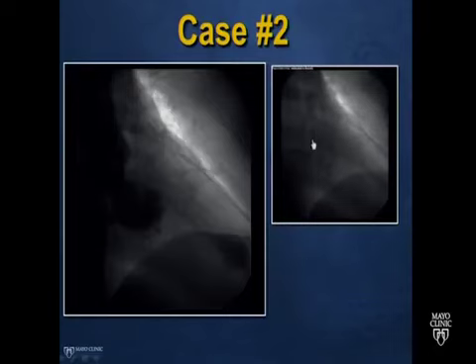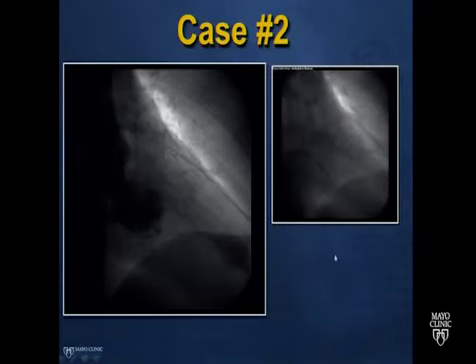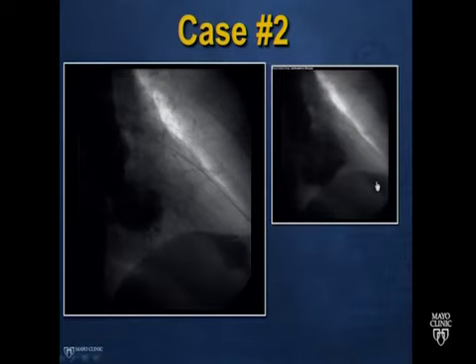Here's another case that you might see. This is apical hypertrophic cardiomyopathy with an apical aneurysm. So again, in diastole, that dye becomes spade shape, and that's because of the thickness or hypertrophy of the LV. In this area, there's an old infarction with an apical aneurysm here.